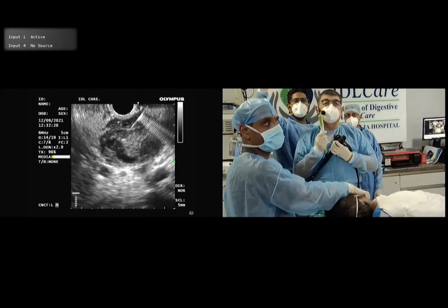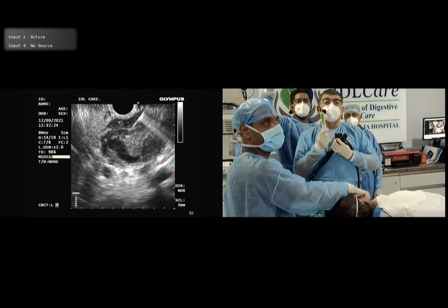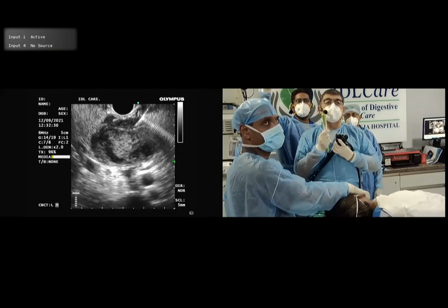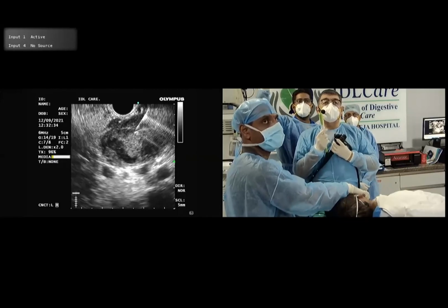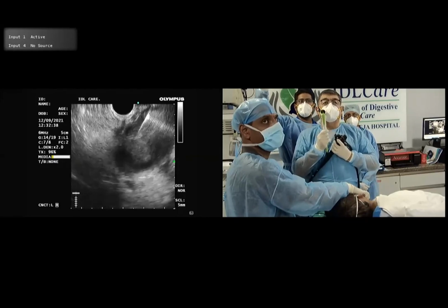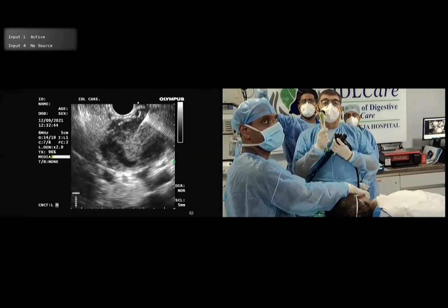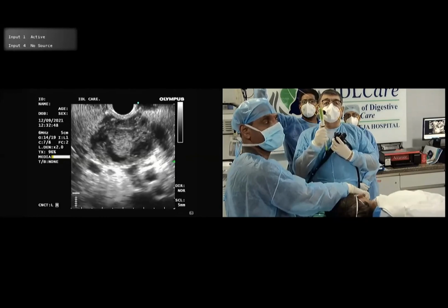See, I went in another direction, and as I'm withdrawing, Bibin is withdrawing the stylet very slowly. Then I try to use my up down to go in another direction. See here, then I go in another direction. Then like that, 4 or 5 different directions you choose using your up down. I'm satisfied with what we have got so far, and we take it out.